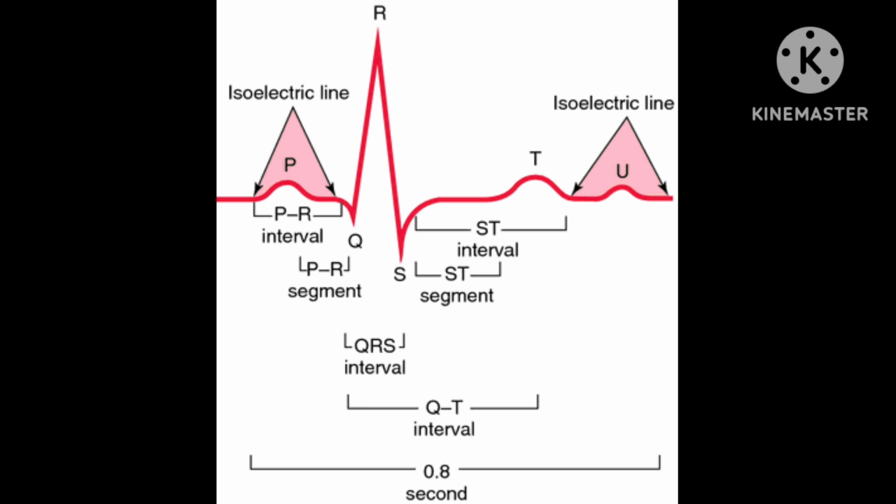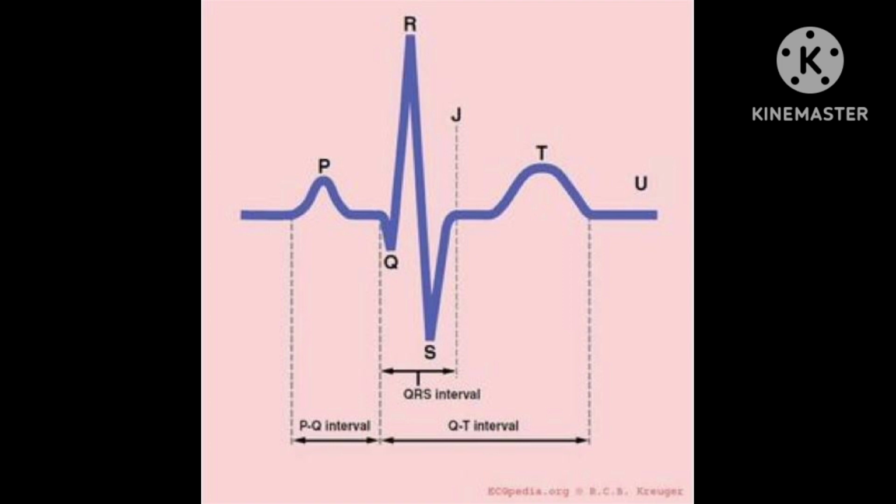After that, the next important point is the process for a resting electrocardiography. For a resting electrocardiography, a person is made to lie in the resting position and electrodes are placed on arms, legs, and at 6 places on the chest over the area of the heart.